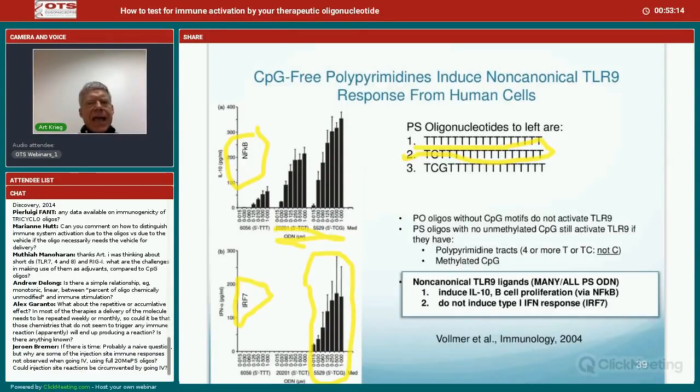The Crithidia DNA assay is a good one. It's much more specific. And so what you'll find probably is that the positive results that you get with the anti-dsDNA ELISA assay are probably not going to be confirmed by the Crithidia assay test. And that is a reassuring thing for regulators.